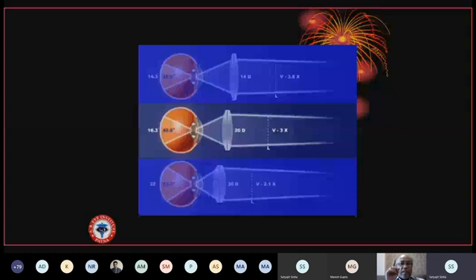Now, I'll just make a point over here. I have never used the 14 diopter lens. I have used the 30 diopter lens for babies, ROP babies, or the people a little bit small. One can see with that 30 diopter lens, because you can do it with little small pupils also. But I've never used a 14 diopter lens. I've never seen one also. So a lot of these things are textbook things. They ask the questions in exams. You need to know this. But this slide is extremely important. It's a very commonly asked question. Thank you, Dr. Pooja. We'll go ahead.